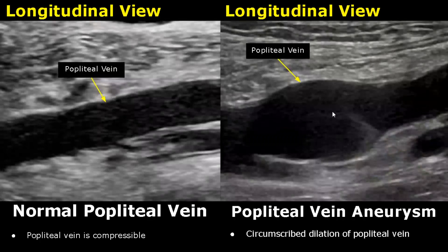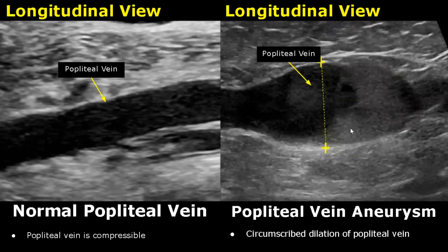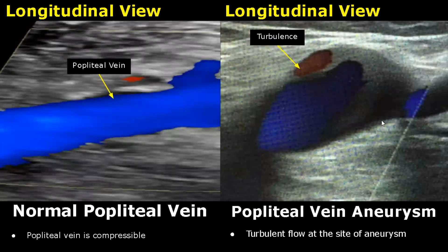Popliteal vein aneurysm is very rare. In this case, you will see a circumscribed dilation of the popliteal vein. Here is another image of popliteal vein aneurysm — there is a circumscribed dilation in a specific part of the vein. Turbulent flow will be seen at the site of aneurysm, and you will see mixing of colors in color Doppler.